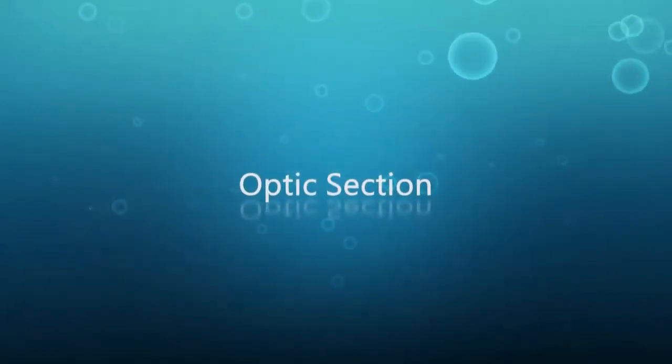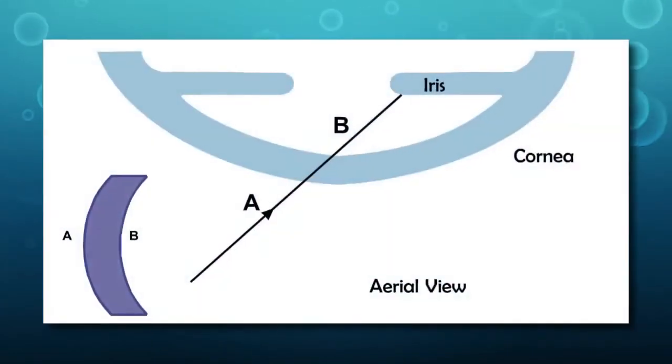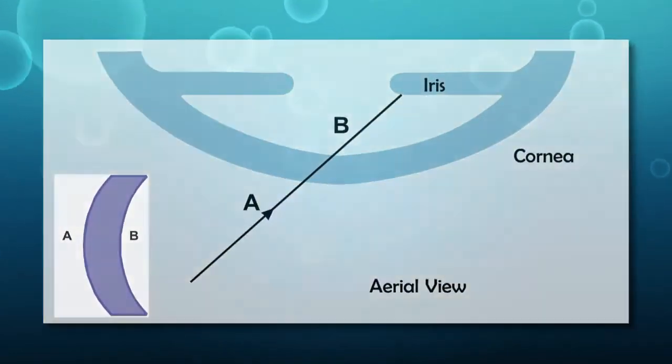Magnification generally begins from low to medium. Optic section. A parallel epiped can be transformed to an optic section by narrowing the slit width to a thin slit.